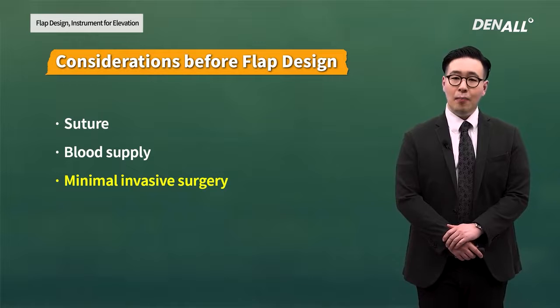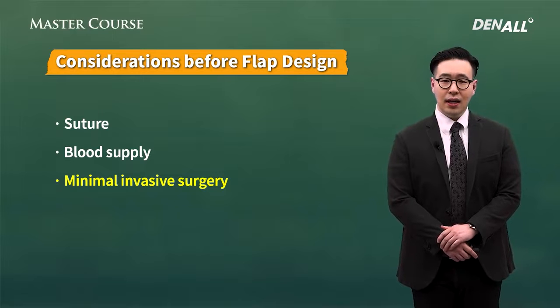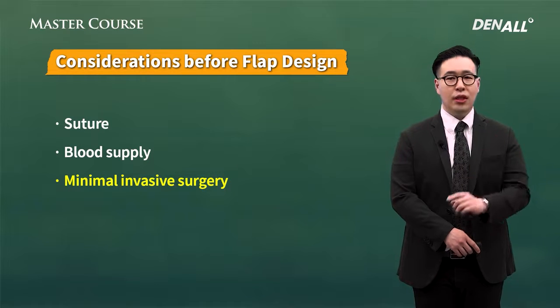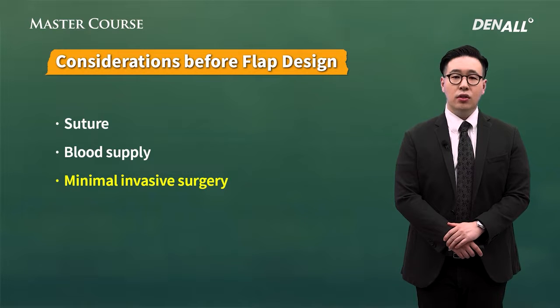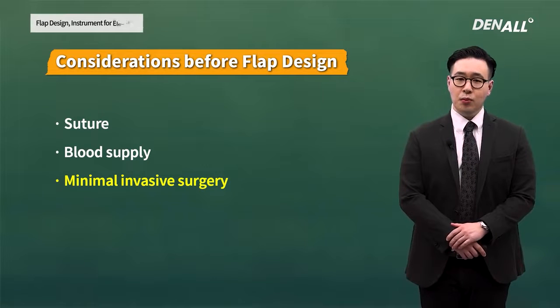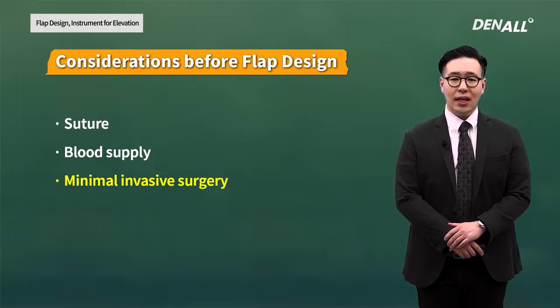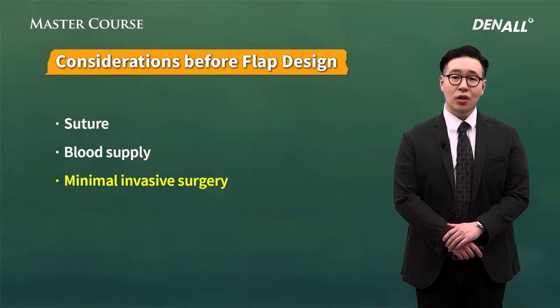Also, if the vertical incision is included in flap formation, I would like to emphasize that the flap should be in the shape of trapezoid for blood flow. After doing many surgeries in this way, if you continue to reduce the size of flap, you'll be able to conduct the surgeries without failure. Minimally invasive techniques. It is favorable for healing, but you need to calculate and form flap depending on different surgery situations, and this requires a lot of experiences.